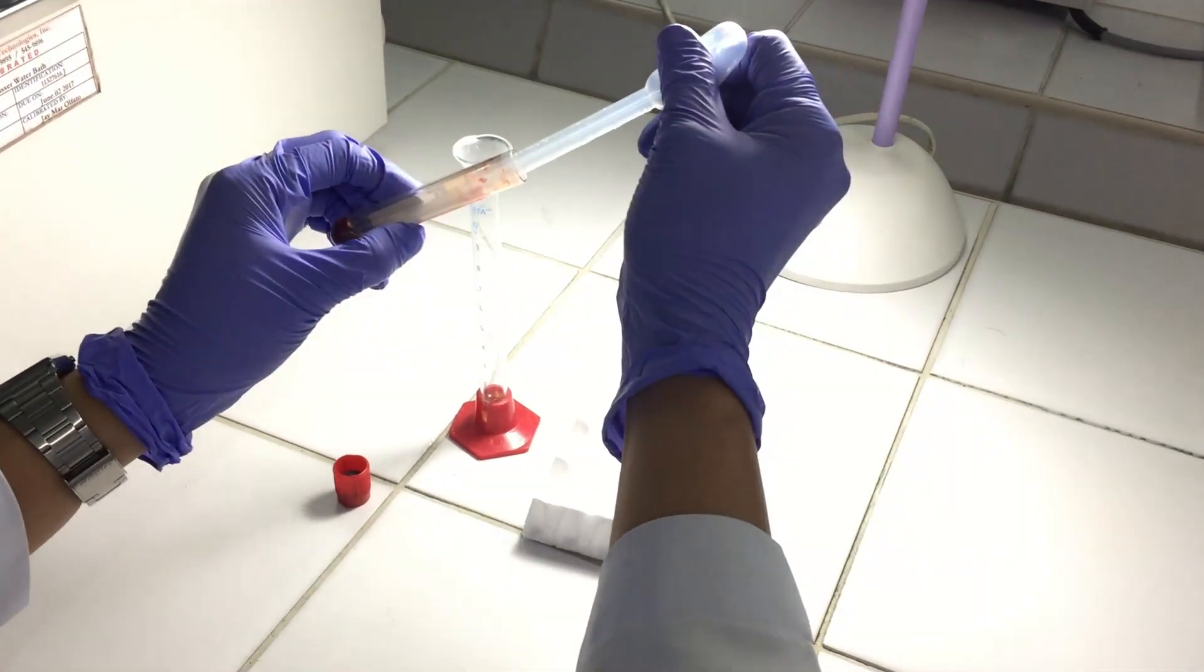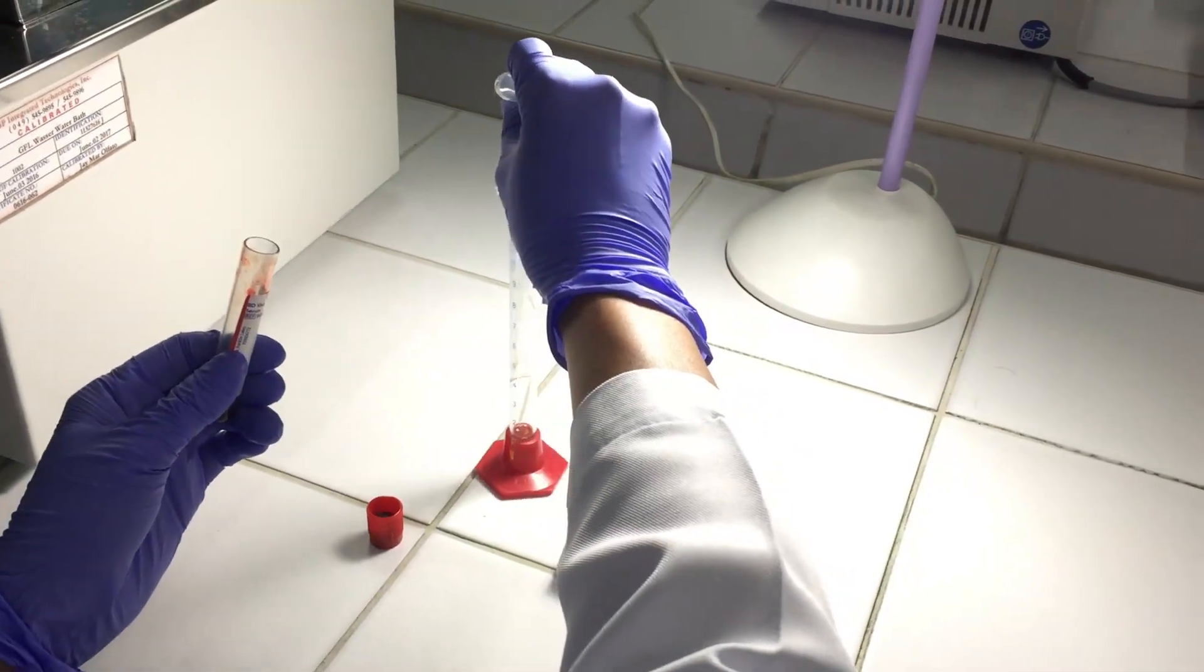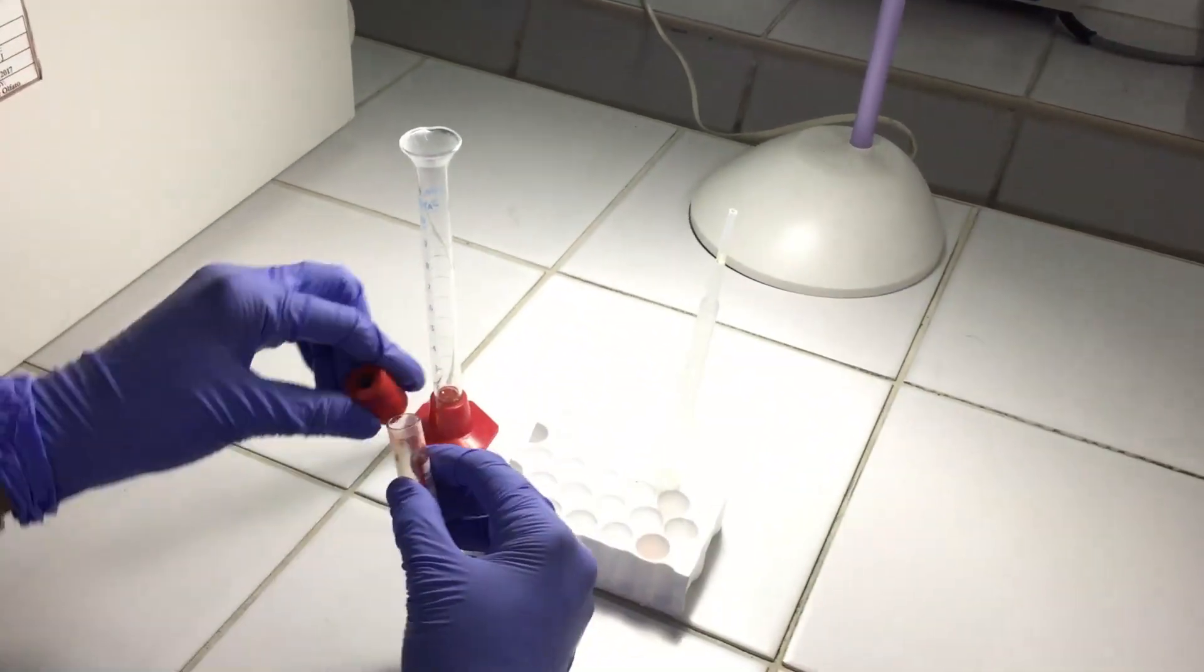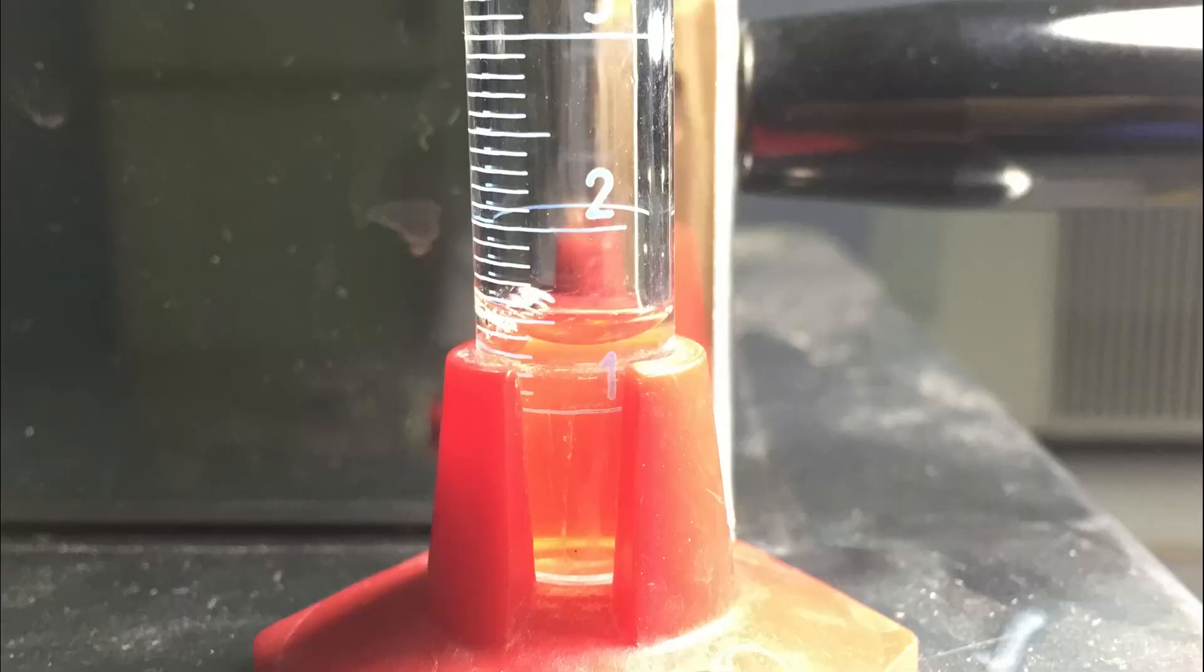Compute using the formula percent serum is equal to the volume of serum divided by the volume of whole blood multiplied by 100.